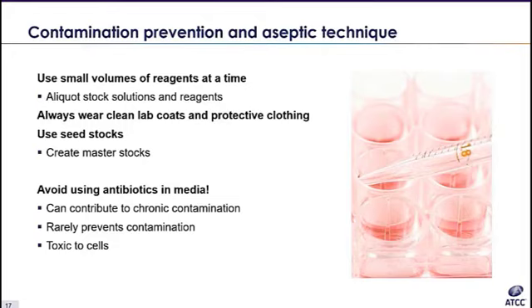There are a few reasons in addition to the potential of toxicity. If you use media with no antibiotics and a contaminant enters your cell culture, chances are it will be visible within a couple of days. You can then discard the infected dishes. However, if there are antibiotics present, it may slow the growth of the contaminant, allowing further passages and freezing down your cell lines. In short, you may be saving large amounts of contaminated cells that can cause problems down the road.